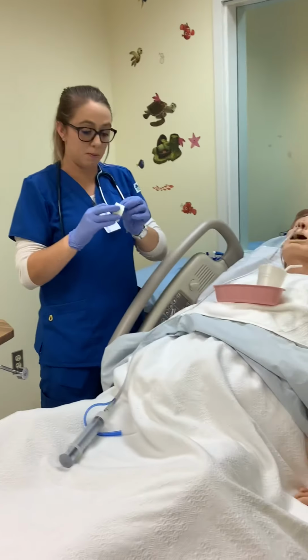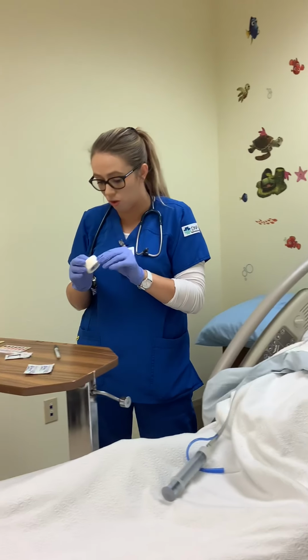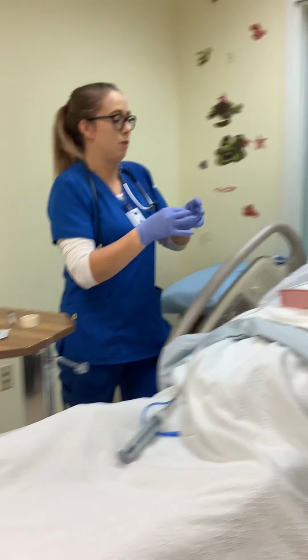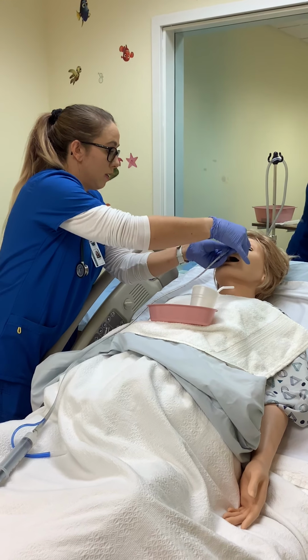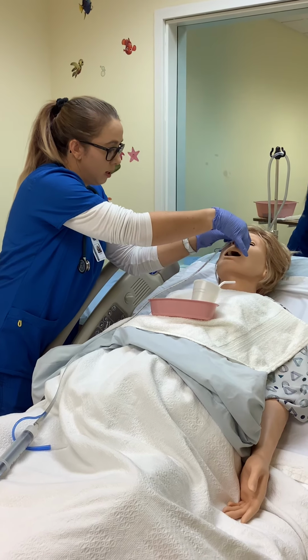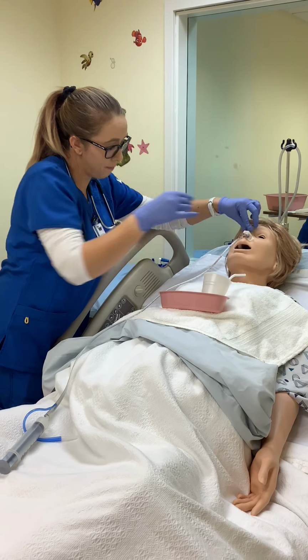For purposes of the video, I'm just going to use tape here, but you would get one of those bandages that would attach to the nose, which we were limited on for the videos. So you just want to go ahead and do that. There we go. Make sure it is there, and it is secured. Okay.